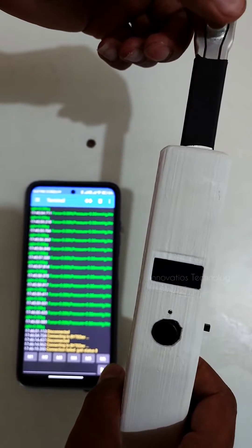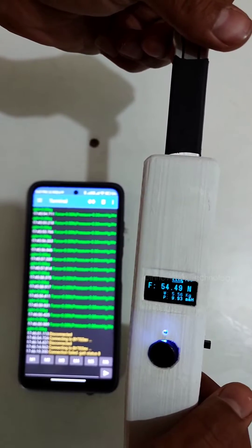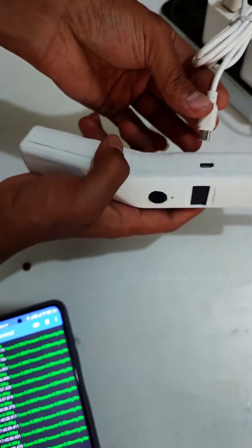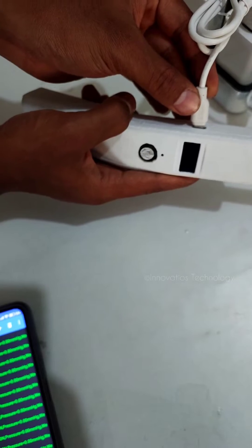Whenever you want to measure again, just press the button and it will start in measuring mode. When you want to charge, plug in a micro USB cable here — any standard charger will work.